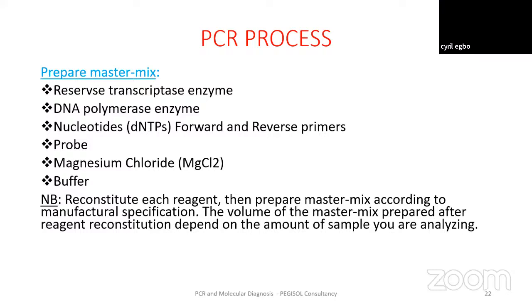Then after which, if you now take the growth of that sample and do DNA extraction and do GeneXpert on it, you will discover that it may tell you MTB detected medium, or high, which means it has amplified to an extent that it can now give you the accurate result that, okay, this TB is viable or is not viable, because at the end of the day, there will not be growth.